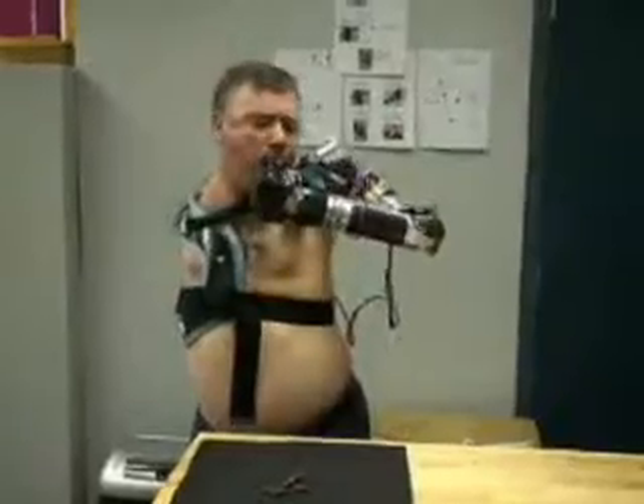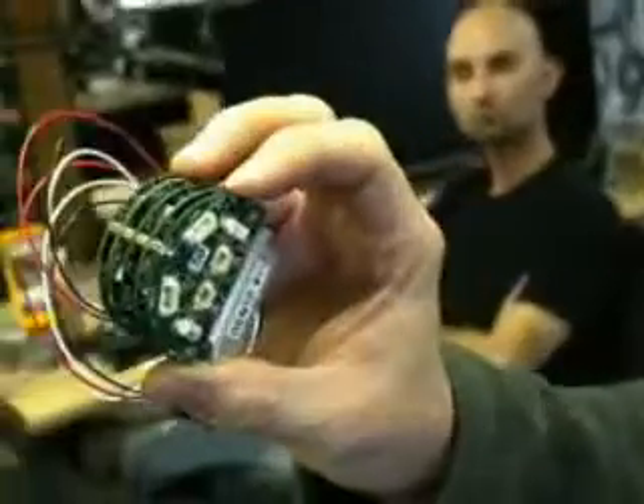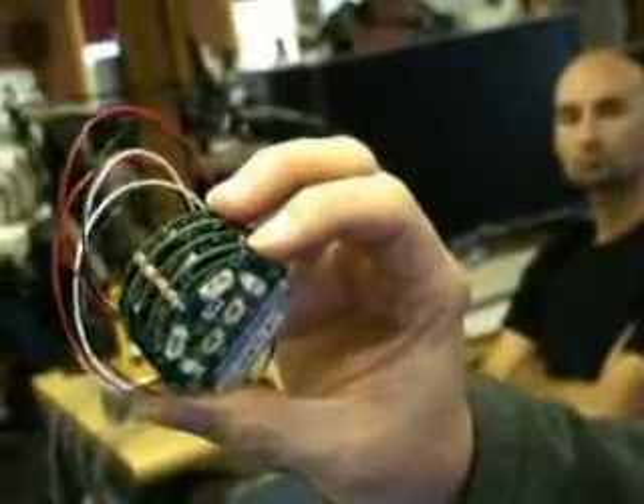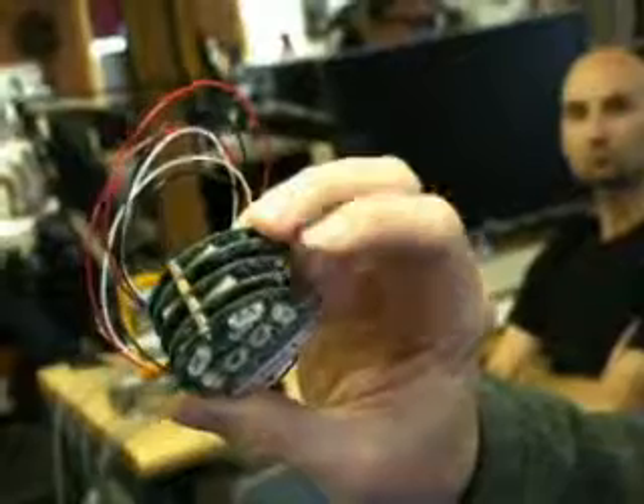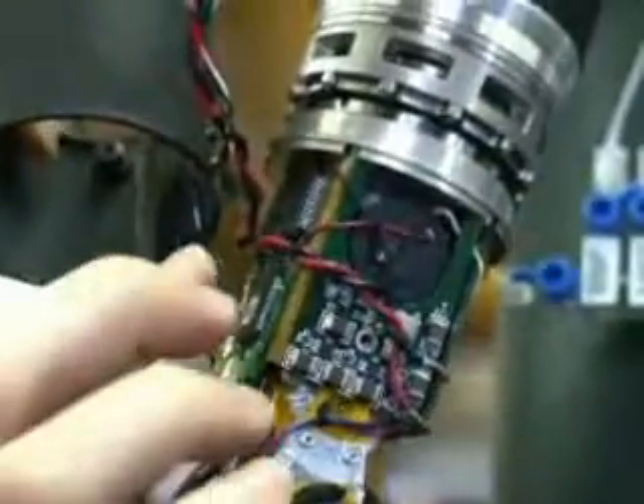The arm is able to handle these complex tasks because of the complexity of the electronics inside. Technology like lithium batteries got within reach in the last few years, and processing became ubiquitous — the size and power consumption of processors got within reach of doing this. There are actually 12 microprocessors in the arm.